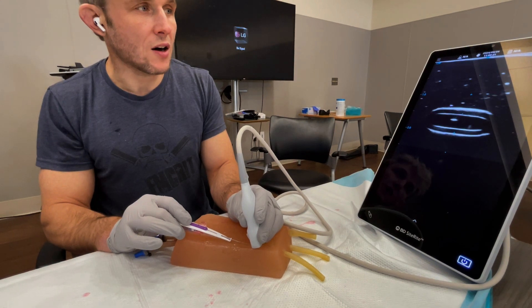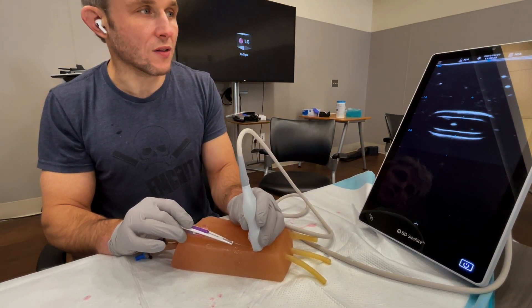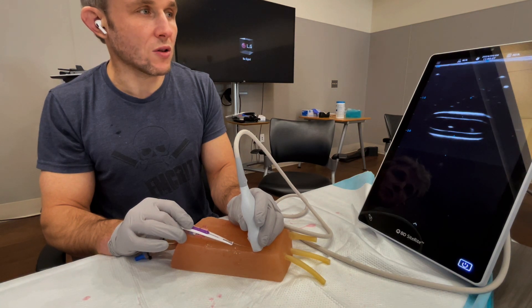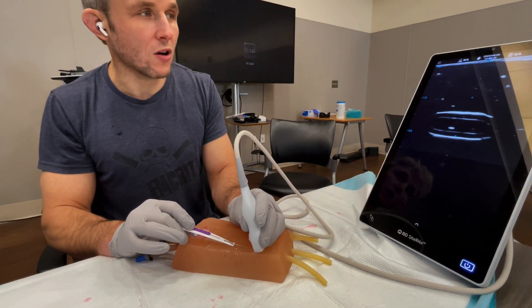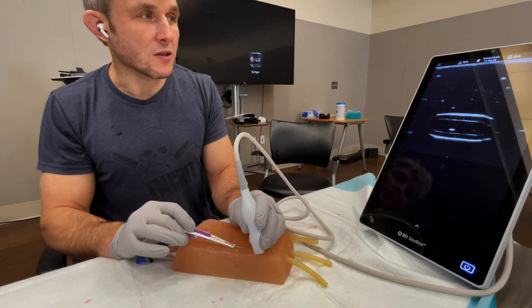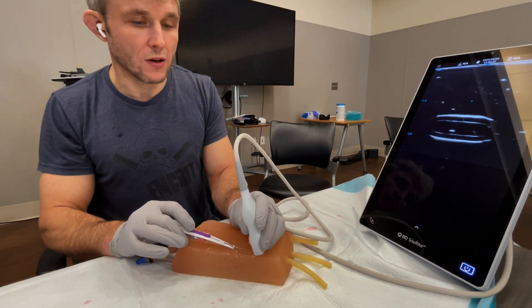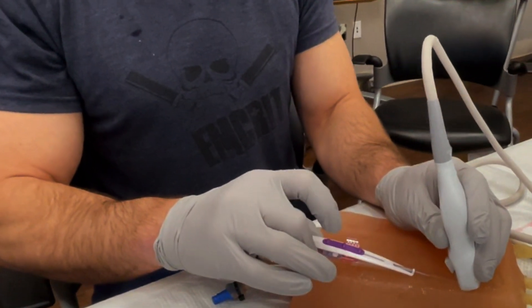I make sure I'm flat, move my ultrasound until the needle tip goes away, then move my needle again — you can see it — and now I'm slowly walking my needle up the vessel. I'm getting towards the back wall, so I've walked up the vessel about as far as I can without damaging the posterior vessel wall. At this point I'll pull back a little bit and then progress my wire.